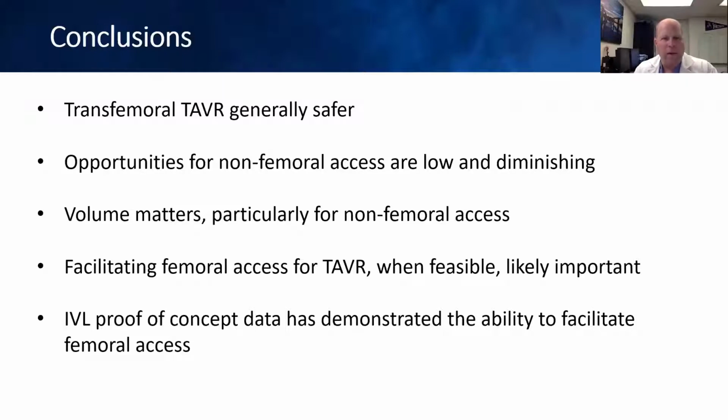And there is evidence that exists now, and a growing body of literature that will be available soon, that intravascular lithotripsy can demonstrate the ability to facilitate femoral access in a safe and reproducible way. So with that, I'd like to hand it over to Dr. De Backer to give us a little deep dive into other alternative access strategies and how they may be incorporated into our TAVR programs.